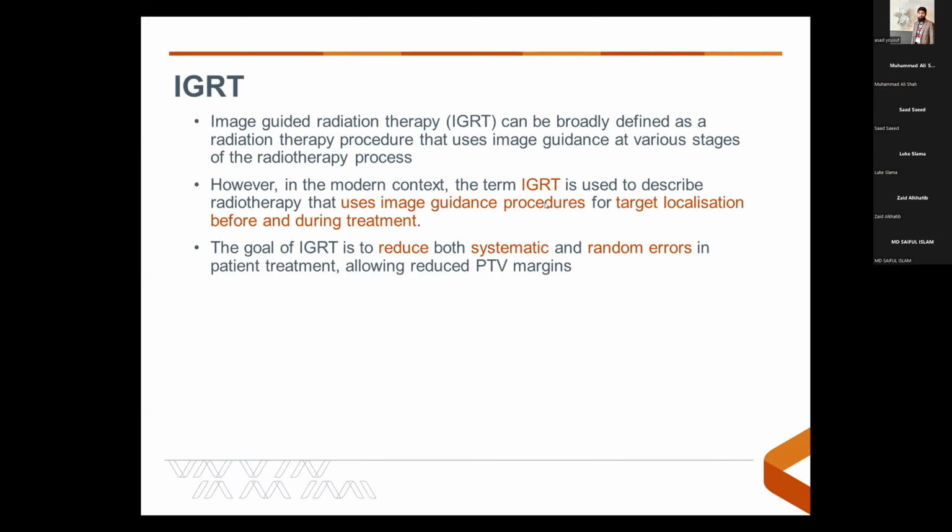Thanks, Luke, for your presentation. Just a quick comment about how to reduce the MU, because Luke is my colleague and we work in the same department. In VMAT, ASC is one way to reduce your MU per gray, by choosing a higher aperture shape controller setting. By increasing to high, you reduce the MUs. By going to low, it will increase the MUs because it will use higher modulation. So, thanks a lot.